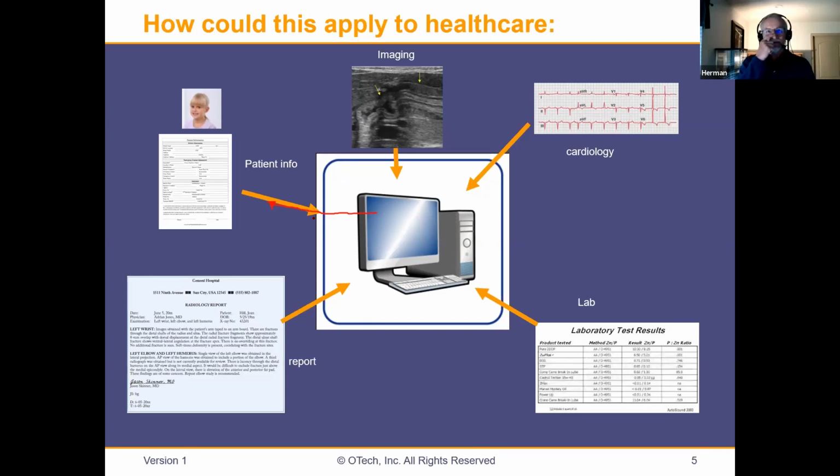So what happens if I have an update? 20 to 30 transactions. What happens if I need to cancel an appointment? How many connections, how many messages do I need to send out in HL7 version 2? Alternatively, if we have a single patient resource, I can access it using a FHIR call.